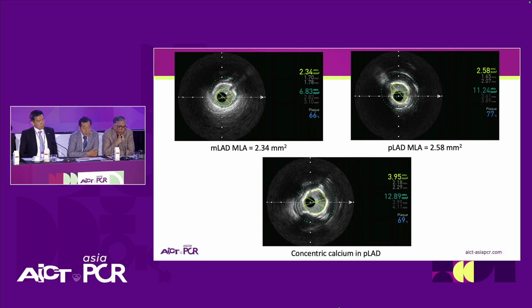So thanks, Mark, Kevin, and Jason for preparing this case. So I think the strategy you mentioned just now was upfront rotor, and you have a 7 French guide. So I guess you have a whole buffet of sizes. I typically use only 6 French, so I don't have that much sizing to play around with. So maybe question to Mark: how are you going to use these findings now to decide on your burr size and why?